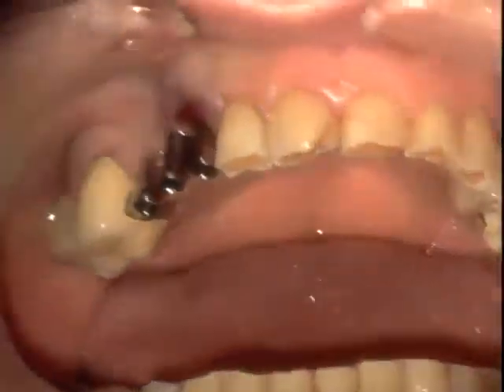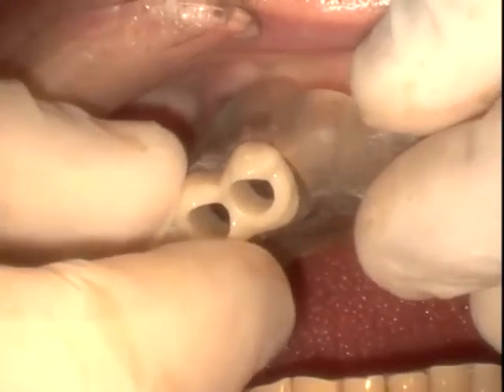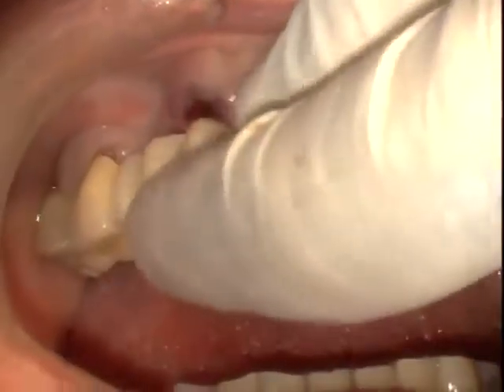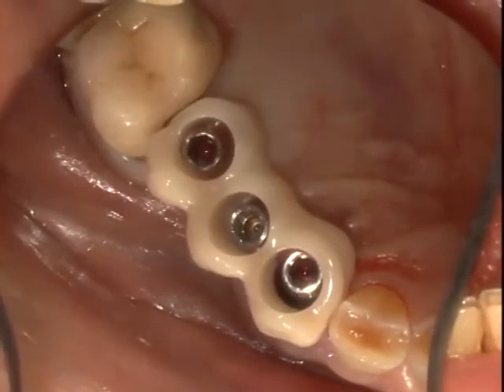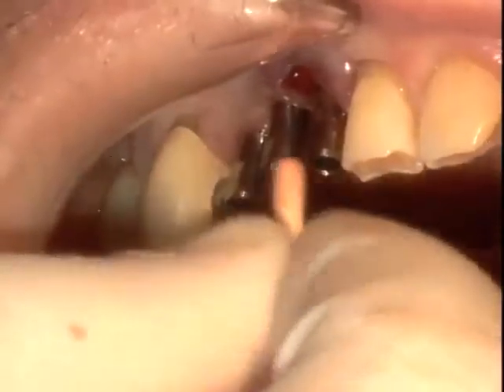This guide is now finally removed, and you can see the temporary that has been fabricated as part of the optical scanning. This being placed in the mouth fits perfectly over the areas where the implants have been placed. It fits with the occlusion, the screw access, and these are the carrier assemblies that have never been removed. Now we have a couple of options here.